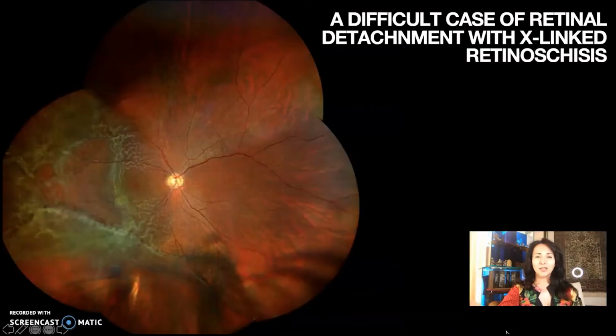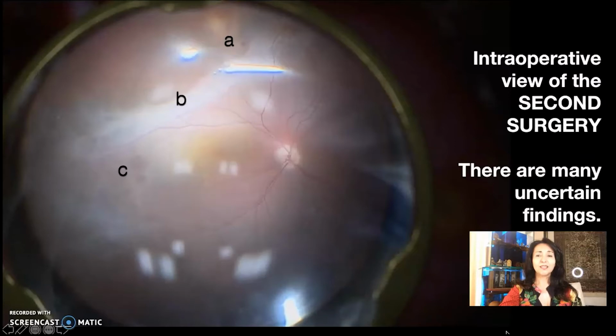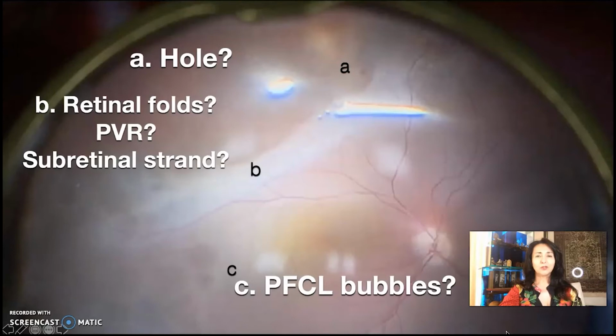Look at this difficult case of retinal detachment associated with X-linked retinoschisis. The first surgery was vitrectomy, removal of the inner layer of the retina, and silicone oil. And this is the intraoperative view of the second surgery for a relapse of detachment. There are many uncertain findings. I was wondering whether A was a hole, B was PVR or retinal folds or subretinal strands, C subretinal PFCL bubbles.